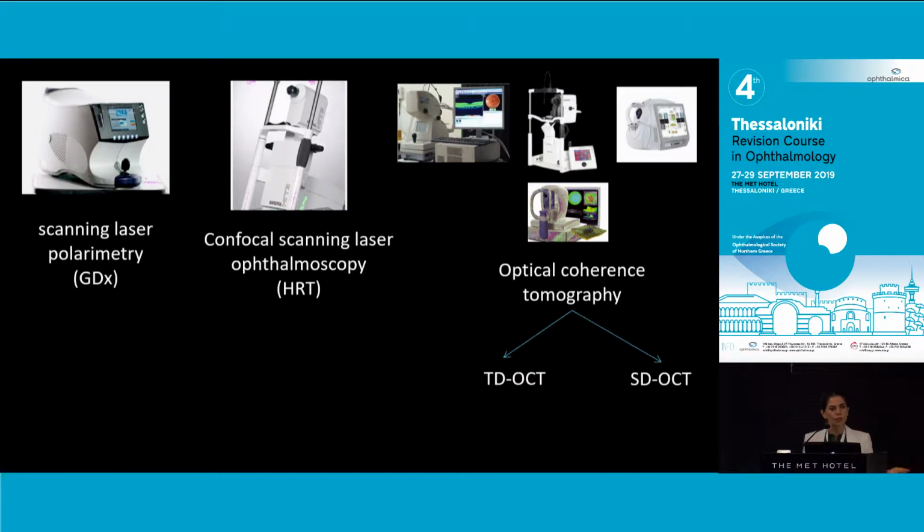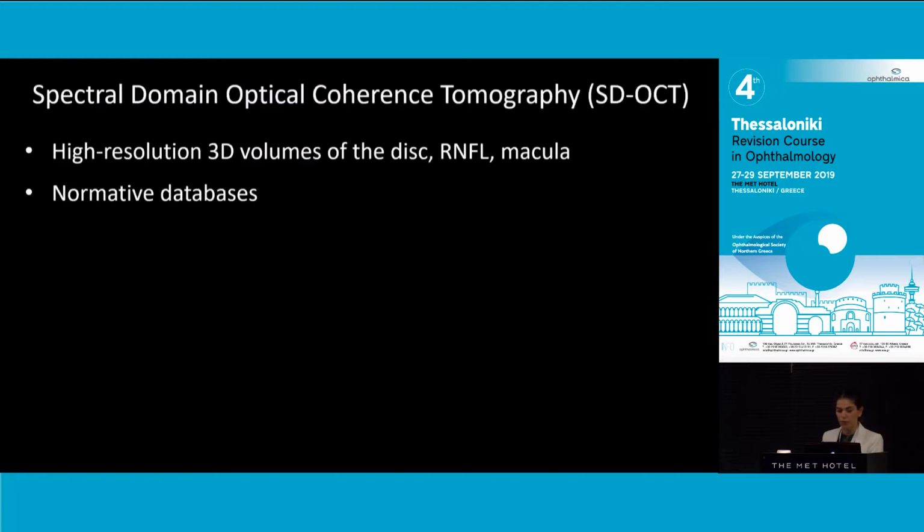So we do now use the spectral domain OCT, but we don't have long years of follow-up, which is why I'm going to show you some examples of how we use imaging for monitoring with the HRT and some examples with the spectral domain OCT. By the way, I do still use the HRT in my clinic because if my patients have had HRTs for long and I don't have an OCT baseline for them, it's more useful to have the HRT. So for a couple of tests, we'll do both, and then we'll abandon the HRT and move on with spectral domain OCT.